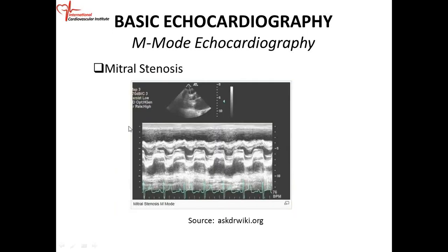All right, so this is mitral stenosis. So cursor is right there, two-dimensional echo is on top. The structures that the cursor passes through, just look, okay? The first thing it encounters is the chest wall, the pericardium, the RV wall, the RV cavity.